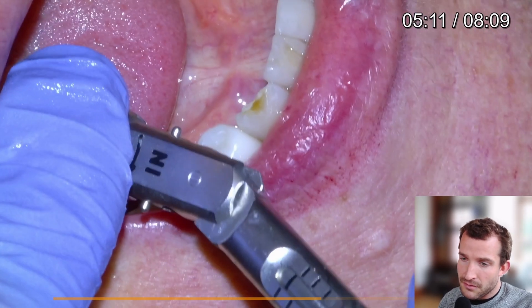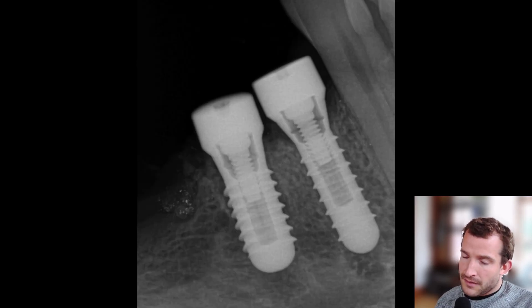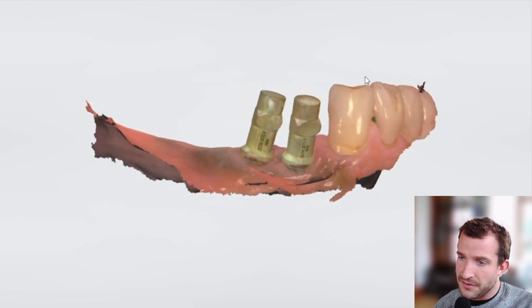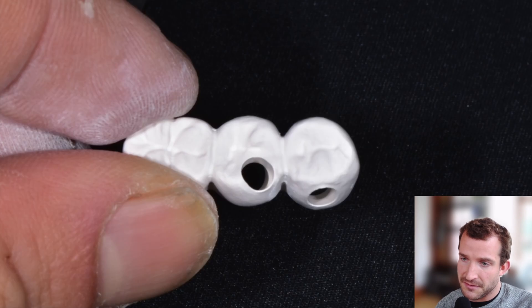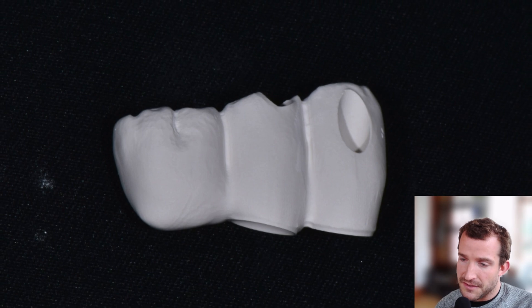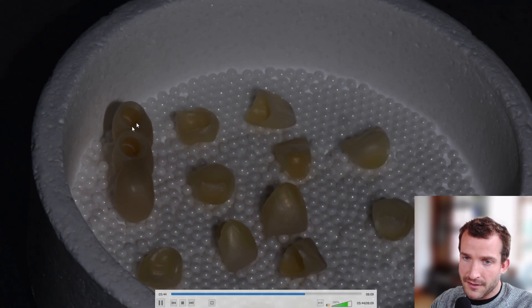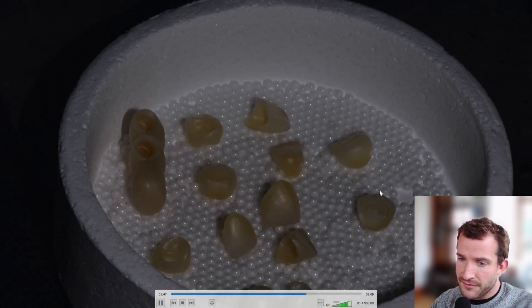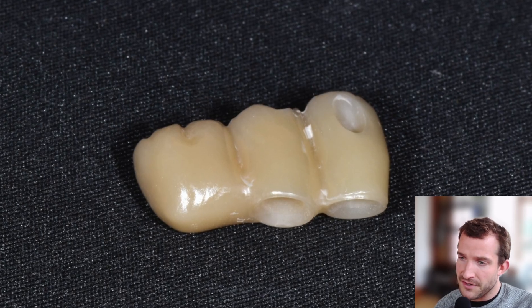There it is installed — now we'll go over the restorative phase. There again is the post-operative x-ray, and here's the scan output from the Trios 4 with our intraoral scan flags. There's the design. Roland milling the unit takes about two hours to mill something like that. We'll cut the sprues out, take the green-state unit, put it in the sintering furnace overnight with some other cases. Here's the case right there — here it is after an overnight sinter. Sintered and pretty polished. There it is polished.